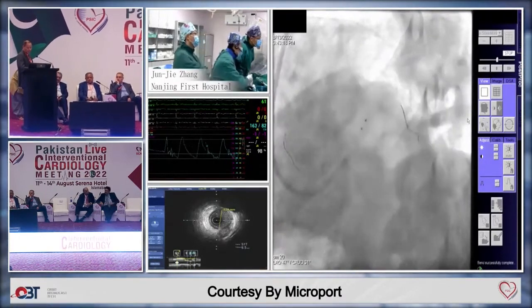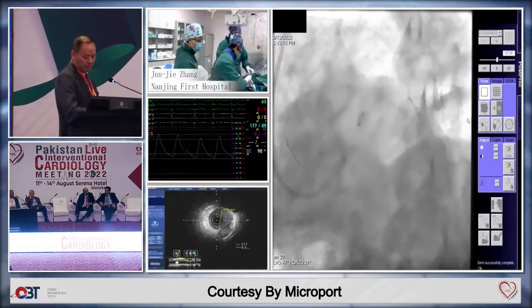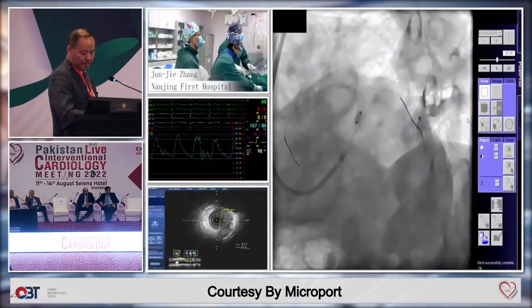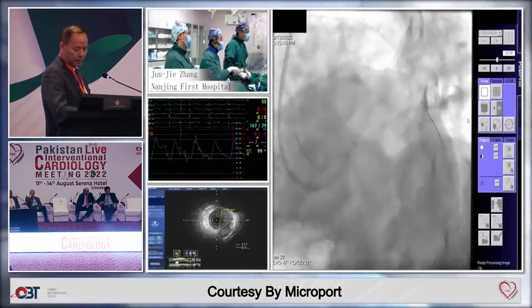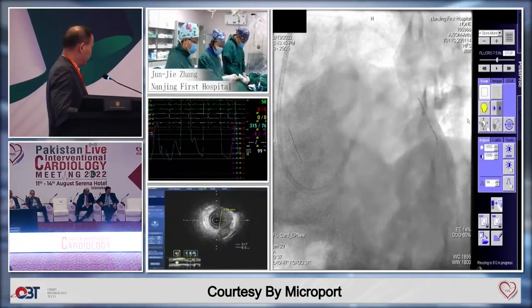Yeah, I think this is a good position. Okay, very short. So you say the distal balloon did not extend distal to the carina. That's very safe for the RAD.